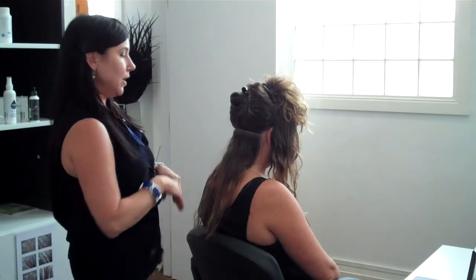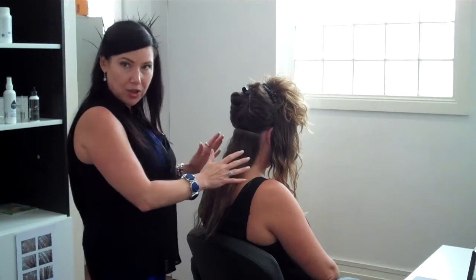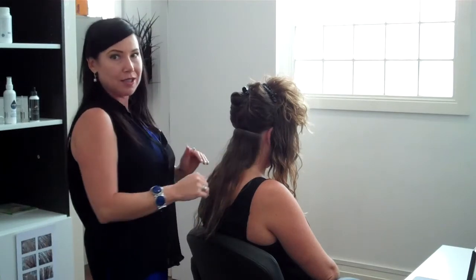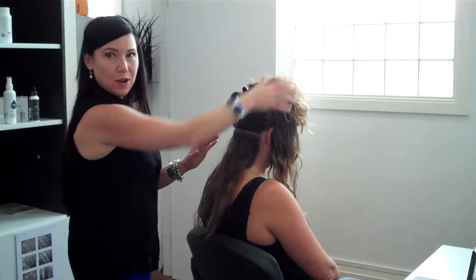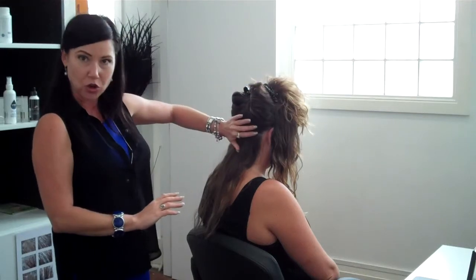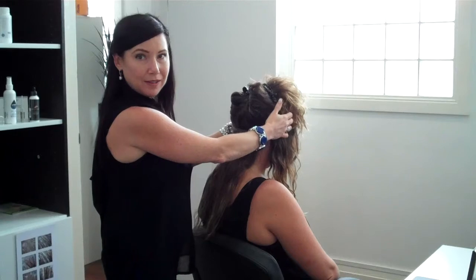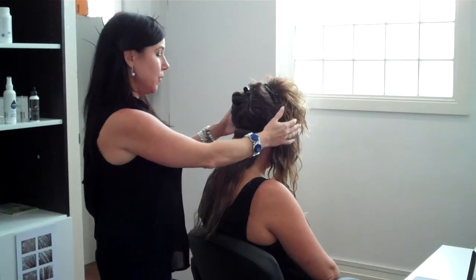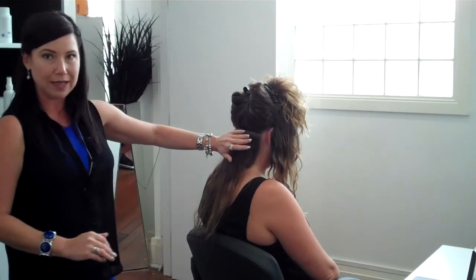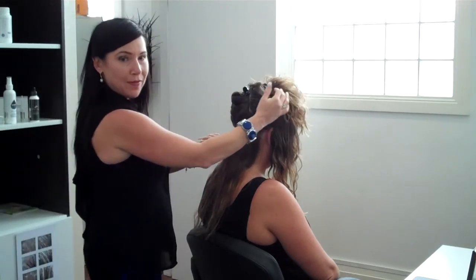When we're going in and doing hair loss treatments on any head of hair, it may not be growing properly. We've already done our diagnosis. In this case we have a hair cycle problem, which we can read through our terminal area, and we also have some pattern thinning going on. So we want to track what's happening in the hair cycle and also the pattern thinning.